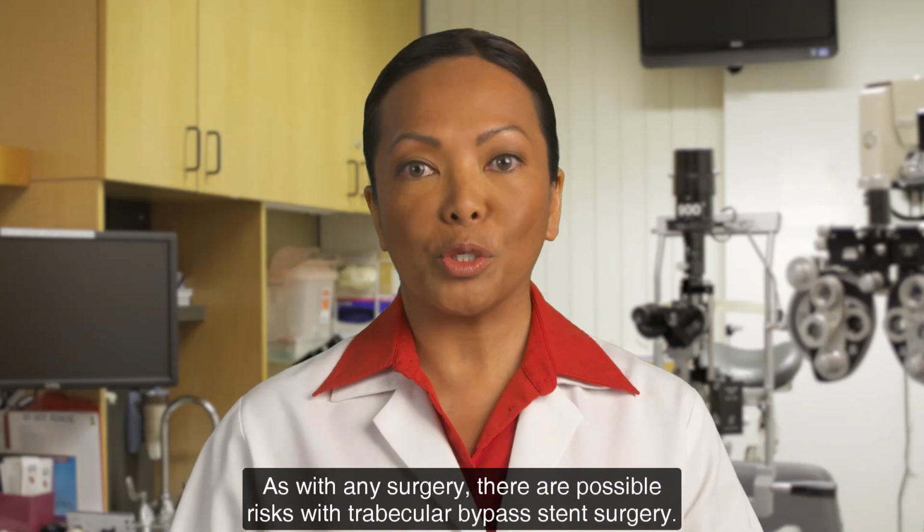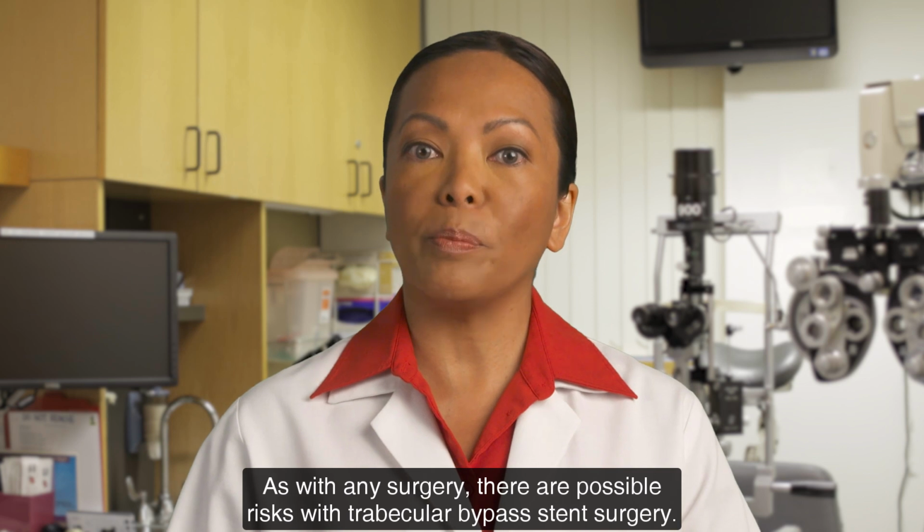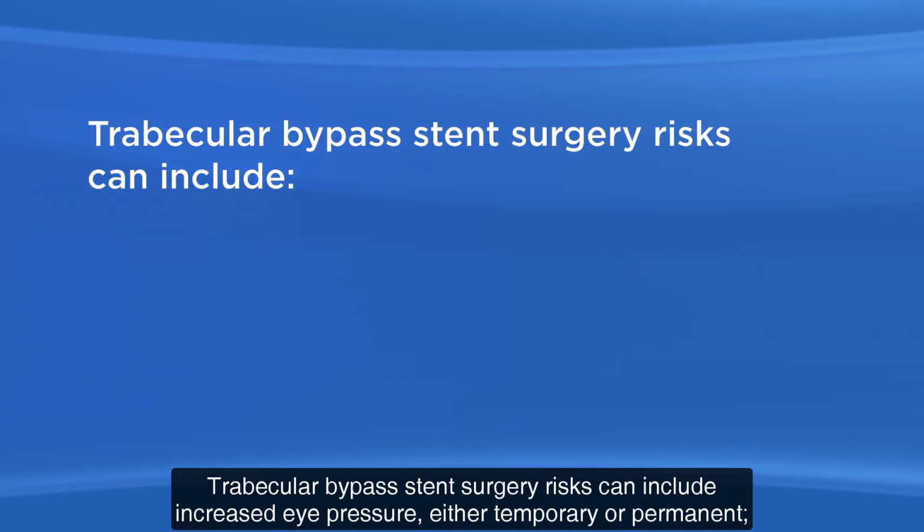As with any surgery, there are possible risks with trabecular bypass stent surgery.